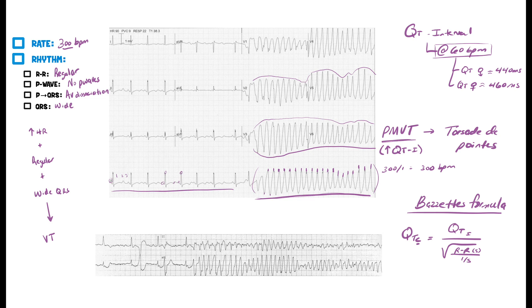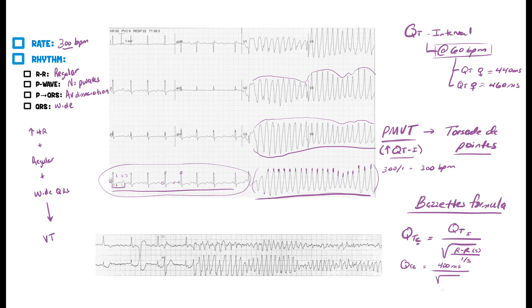Let's calculate the QT interval using this example. We'll go from the start of the Q-wave to the end of the T-wave — that's our QT interval. One box is 0.2 seconds, so two boxes is 0.4 seconds, which is about 400 milliseconds. So QTc equals 400 milliseconds divided by the square root of the R-to-R interval — but this has to be in seconds.